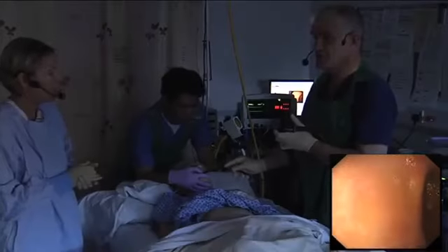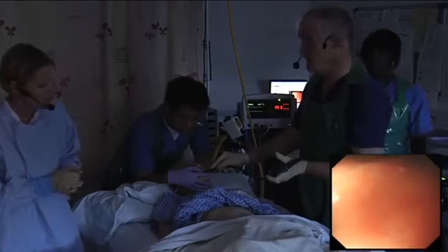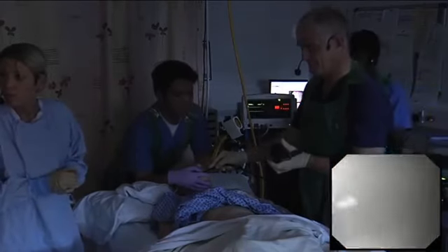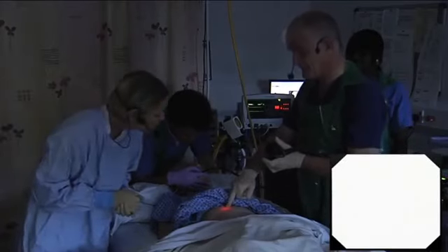Often you find when people have had previous surgery, it doesn't actually quite react as you expect. I'm just going to transilluminate once more. Yep. Okay, we're right up here. There. Okay. Do you just want to move that away?